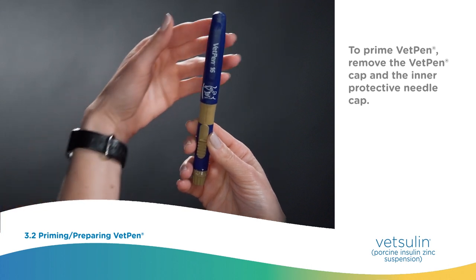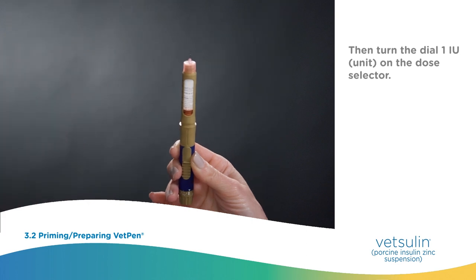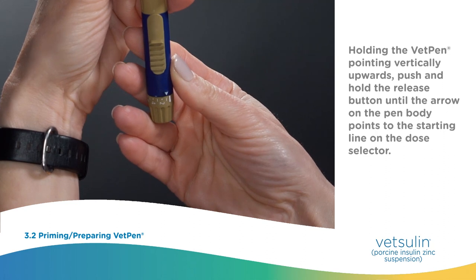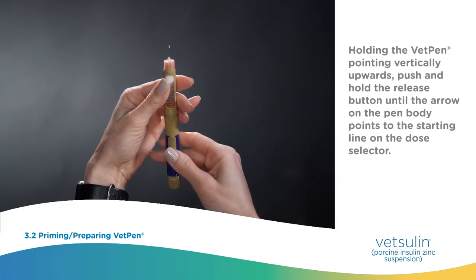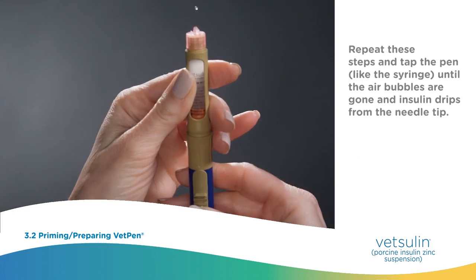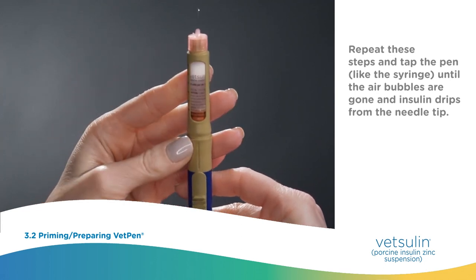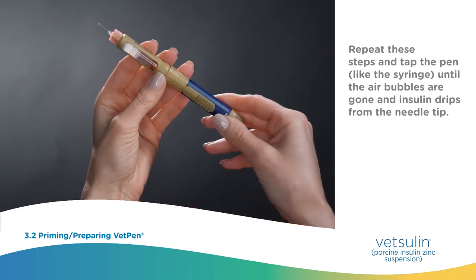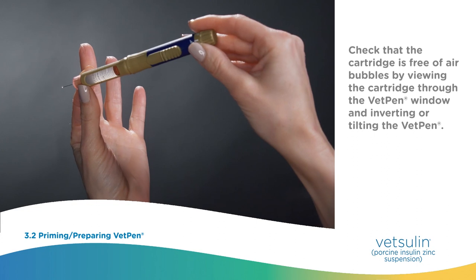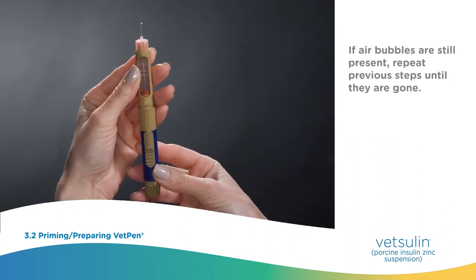To prime VetPen, remove the VetPen cap and the inner protective needle cap, then turn the dial 1 unit on the dose selector. Holding the VetPen pointing vertically upwards, push and hold the release button. The arrow on the pen body points to the starting line on the dose selector. Repeat these steps and tap the pen like a syringe until the air bubbles are gone and the insulin drips from the needle tip. Check that the cartridge is free of air bubbles by viewing the cartridge through the VetPen window and inverting or tilting the VetPen. If air bubbles are still present, repeat previous steps until they are gone.